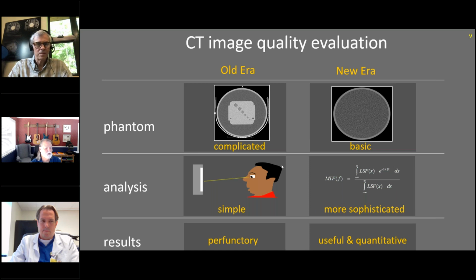And so the state will just look to see if that scanner is accredited, and then by default, they're accepting the dosimetry metrics and the image quality metrics and some other metrics having to do with the people who are reading and the people who are taking them, the technologists, the radiologists, and the physicists. So that has become a more recent thing in the last 10 years where the states are deferring to an accreditation procedure. But thanks, John. That's super helpful. Yeah, thank you.